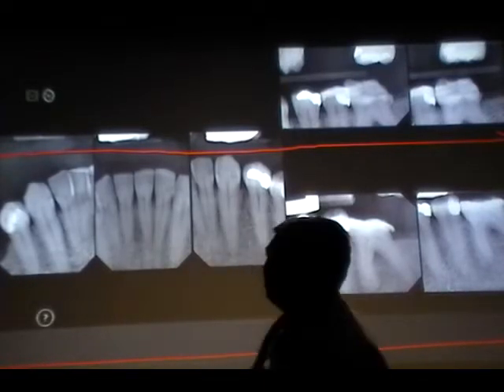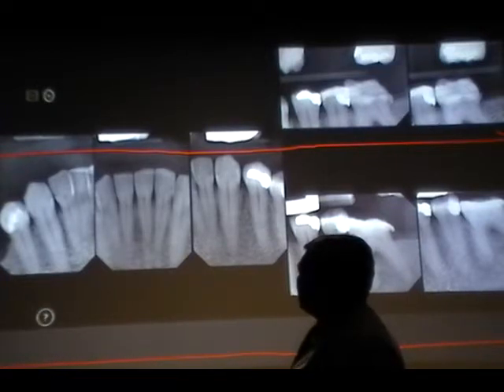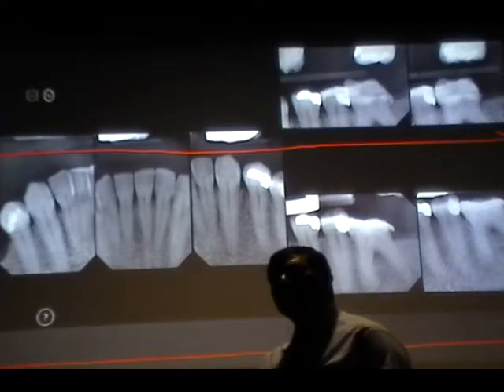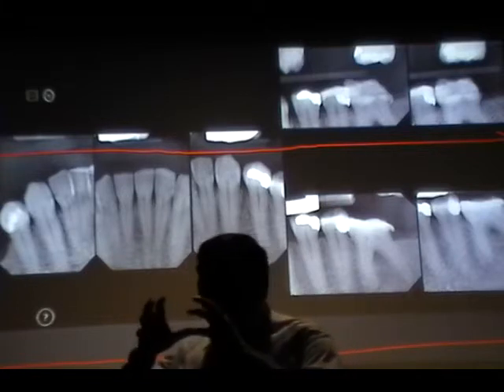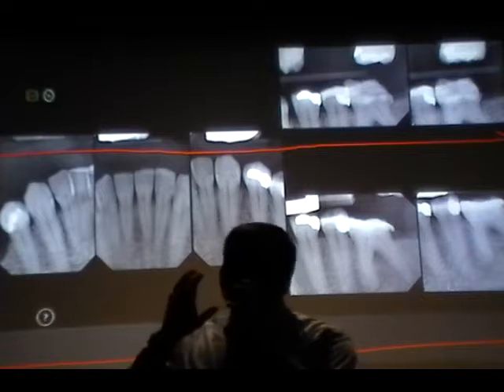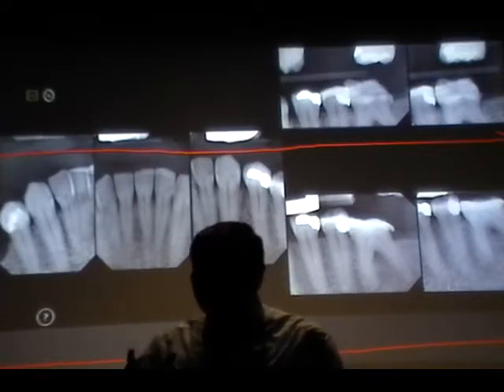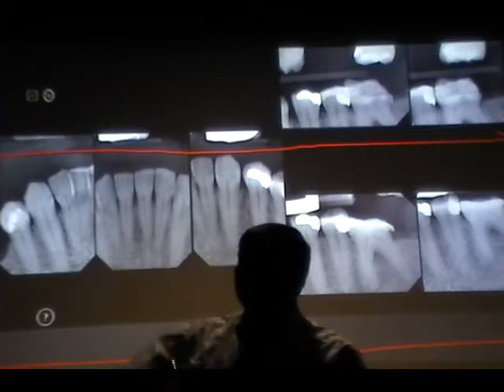I mean, there are no open contacts on the inside of it, but it's in the one over, so canine. I guess maybe more of the apex in this. Yeah, apex, one of the criteria that we look at in periapical radiography: are we capturing the apex or not? In this case, absolutely no, we are not able to capture. So the patient did not bite, so we are capturing more of superiorly.